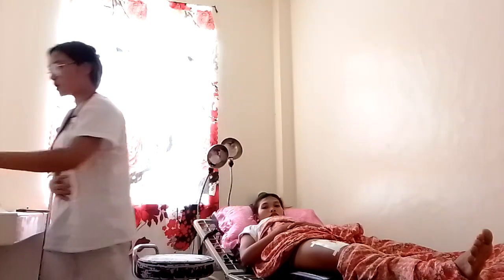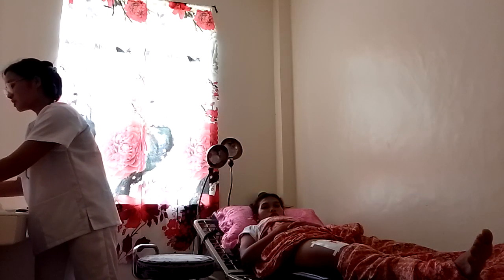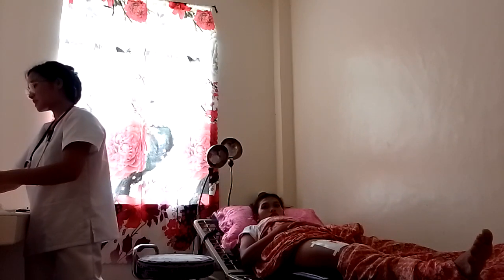But before we proceed to that one, I have here some equipments. I-ready sa na ako mga equipments para on the flow na ang akong pagbuhat sa wound care sa ako ang pasyente. Okay, so I have here alcohol. I also have here tissue. The wet and dry dressing kit. Sterile ni siya, so ako lang siya gibutang diri sa iyang sudlanan. I also have here tissues for wet and dry dressing and some cotton balls para sa paglimpyo sa samad.